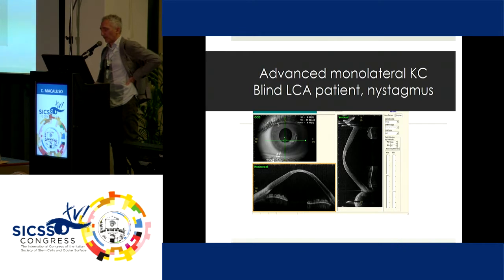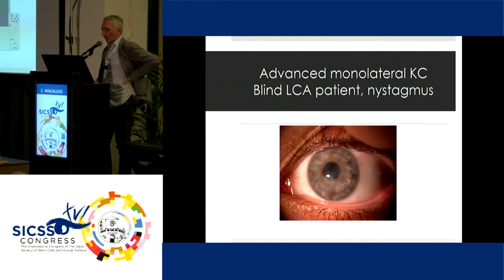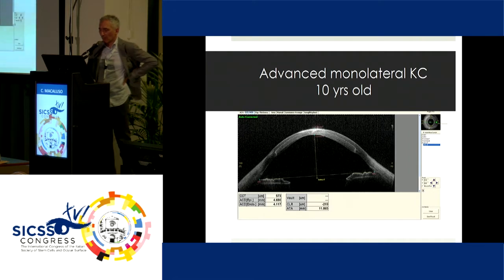These are two patients with a peripheral pocket. This is a blind patient with a nystagmus, a congenital disease, and here we have introduced into the preserved lamella. So it was really a scary nystagmus, but the corneal structure, however, has been considerably improved and restored. He had no problems. Of course, he doesn't see, but it was, however, useful for him and for us to understand whether this was feasible, although we aren't perfect yet.